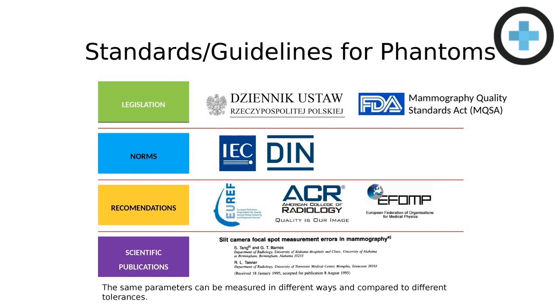Standards. When we're looking at various standards and guidelines for phantoms, they can vary. They can be driven by county or state regulations, and these standards can vary in ways. In some cases, hospitals and medical physicists have to establish their own routines for testing. I think most important is to have repeatable and reliable constancy tests. Constancy tests are procedures used to check the output of a diagnostic imaging system and make sure that it remains constant over time.